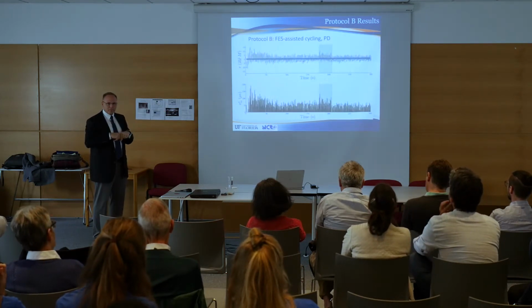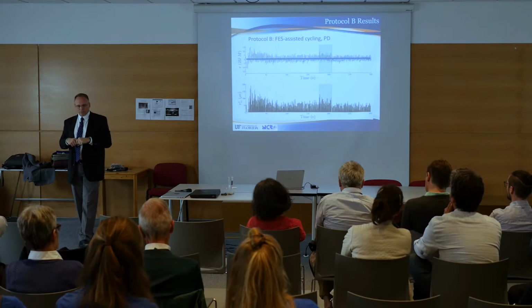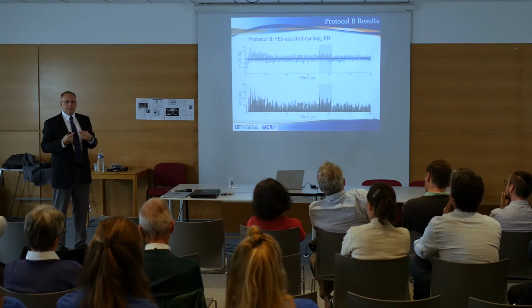Then we did another protocol on someone with Parkinson's disease. The intensity of stimulation required to yield cycling for them was too much. And so in our healthy normals, they didn't get to see the desired trajectory or their actual performance. So they had no clue what was going on. They were just being stimulated and we were recording it.